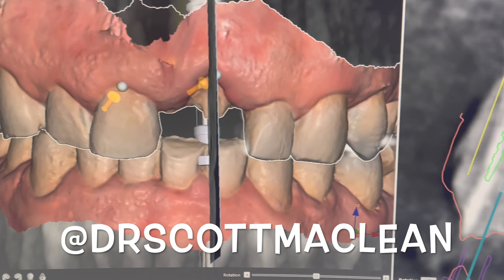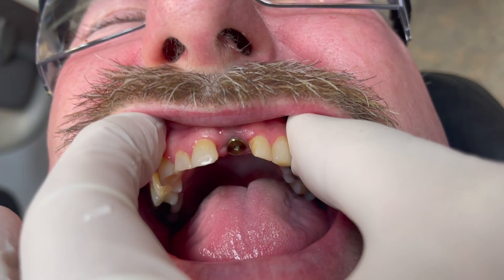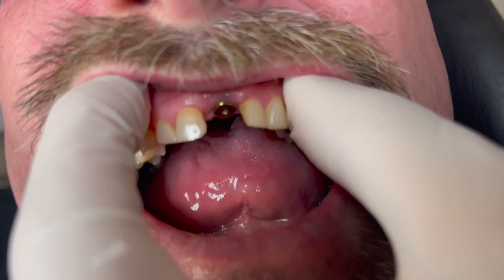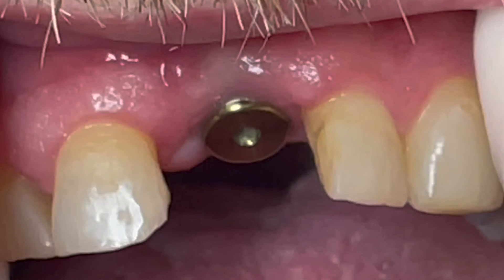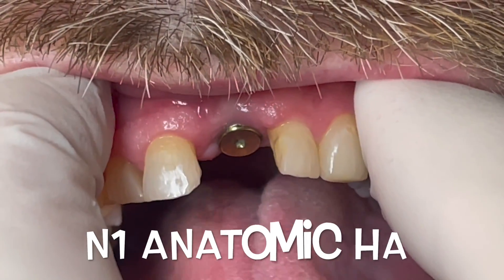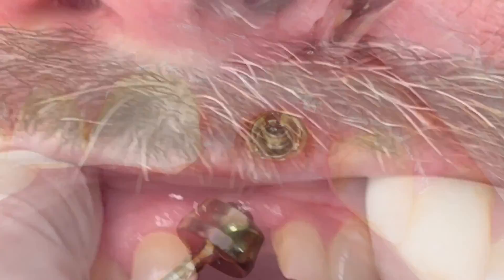No extra tissue was added on this case other than the bone grafting, which was some allograft. Here's the abutment — you can see the anatomic abutment is quite wide, a lot wider than the implant, and this allows us to create the emergence profile needed for this restoration. The bone is up over the platform, so you can see very amazing healing. When we take the anatomic healing abutment off, you'll see the emergence profile.